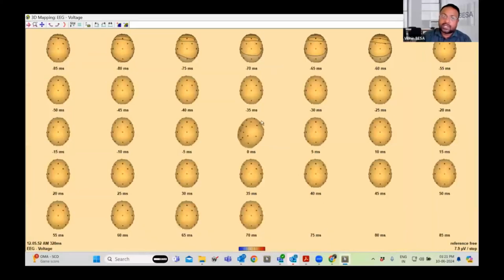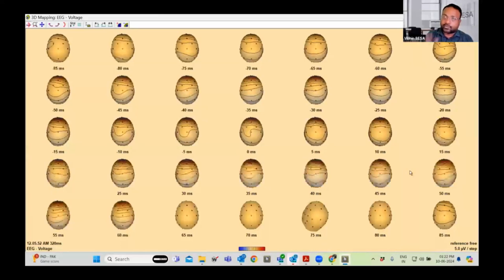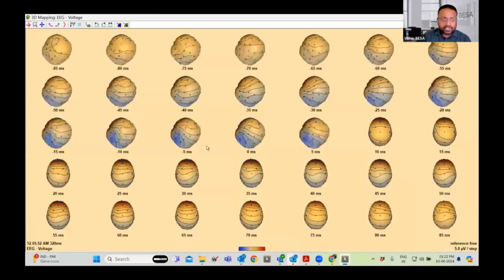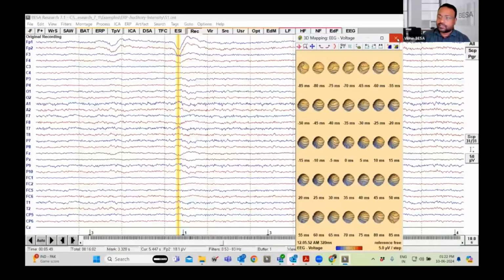This view is really helpful to see how the propagation, or what happens just before or after your cursor point. So here you have the 0th point. This shows you what happens before 5 milliseconds, before 10 milliseconds, before 15 milliseconds, up to 85 milliseconds back in time, and also forward in time. How does the electric field evolve or change during this period? Let me just minimize this and close this.